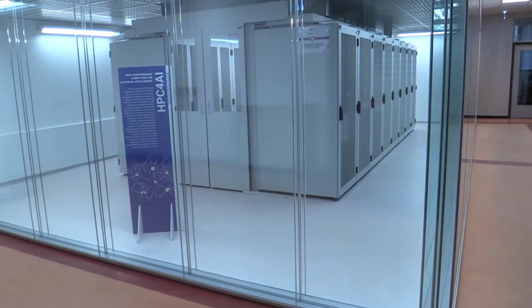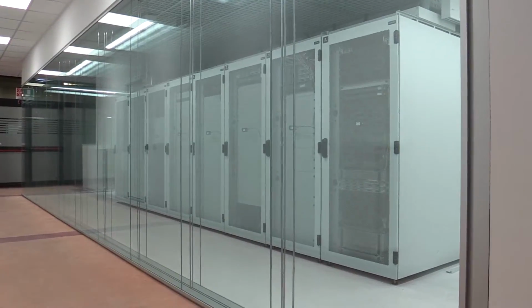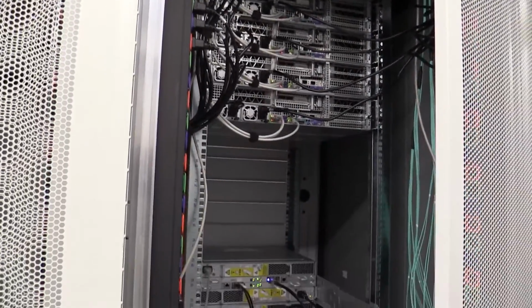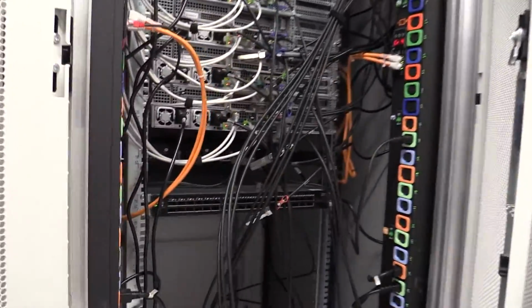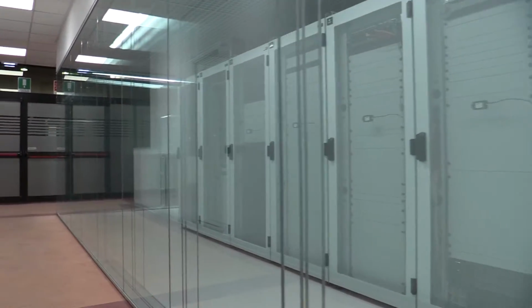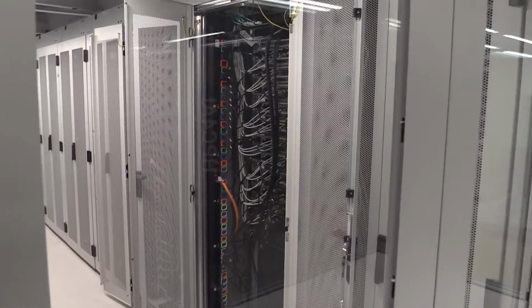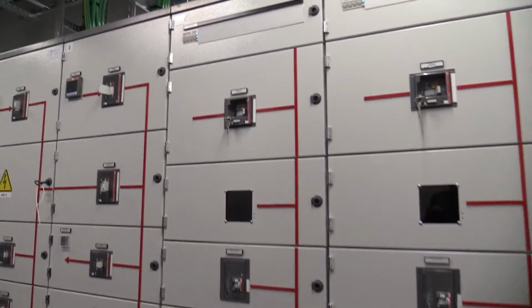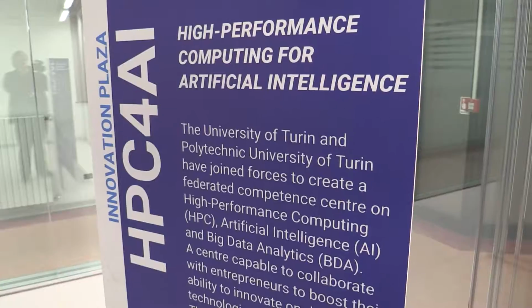DeepHealth exploits the usage of AI tools thanks to several software platforms, including the University of Torino's OpenDeepHealth platform. It supports the training and inference of AI models on hybrid cloud HPC infrastructures. The key technology underneath the transparent deployment of AI tasks onto multiple infrastructures is the StreamFlow Workflow Management System. Also, the University of Torino implements a pilot hybrid cloud HPC infrastructure, which is composed of the Occam et Unito HPC modular cluster and the HPC4AI private cloud.